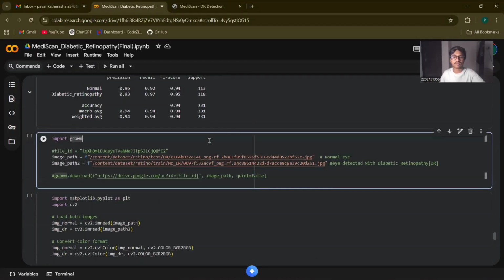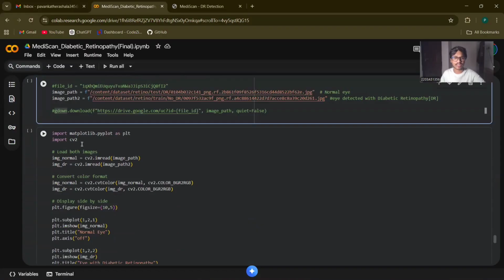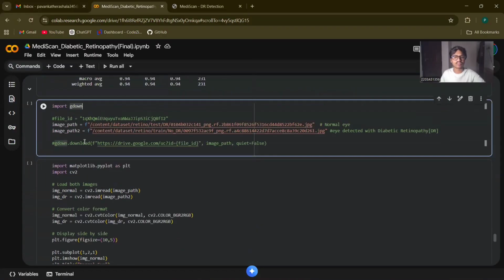So here, our first step is the data setup and access. Here, we started by importing the gdown library. This tool is often used to easily download files stored on Google Drive directly into our coding environment, which is commonly used when working with large datasets and platforms like Colab. And next, we defined the image locations. So these two lines define the exact file paths of the system where the two example retinal images are stored.